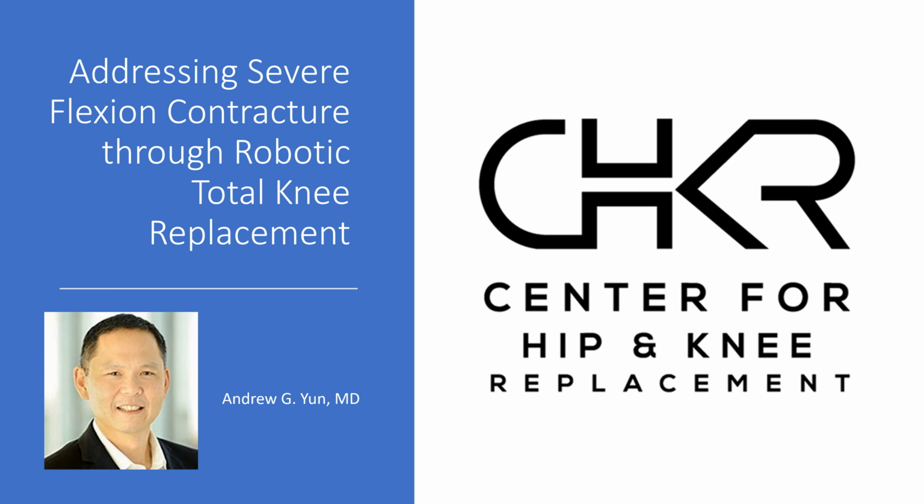Sometimes you'll get it perfectly, but oftentimes you'll be required to do fine tuning in flexion on the PCL, and also in extension with your components in place. And then at that point, you'll switch to a gap balancing method. And in using these more traditional methods, you'll be able to maximize the ability to quantitatively make small adjustments using the robot.